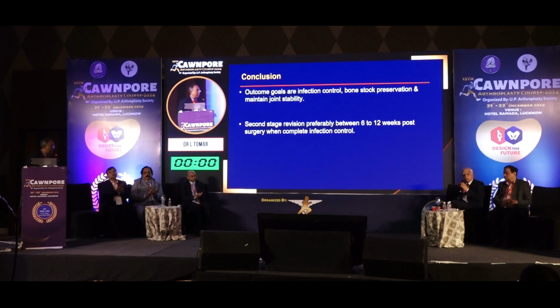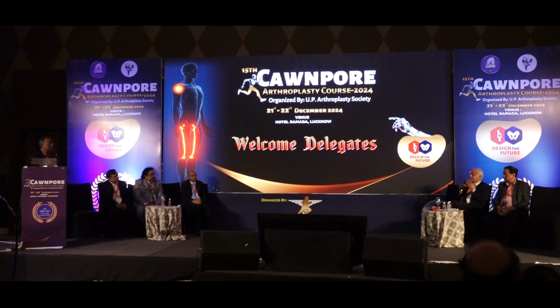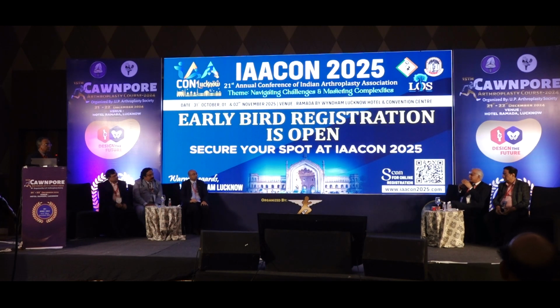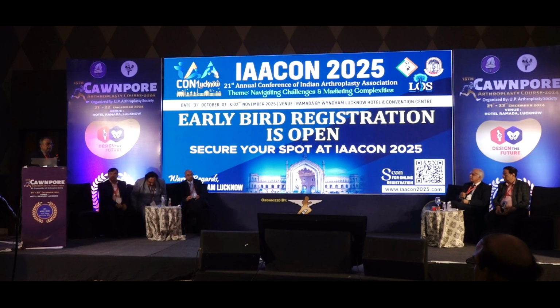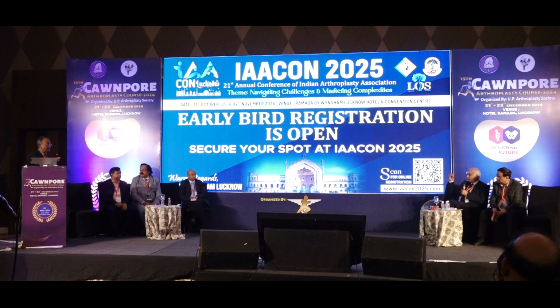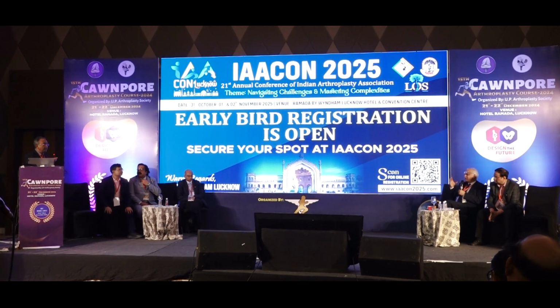Thank you, Dr. Tomar. One problem I face with articulating spacers is I can never get that kind of stability because they're fixed sizes. So you put it on the femur. Now, how do you make it a very tight fit so that there's no medial lateral instability? There are CR types, there's no peg there, so sometimes they're very unstable. They're not that stable mediolaterally.